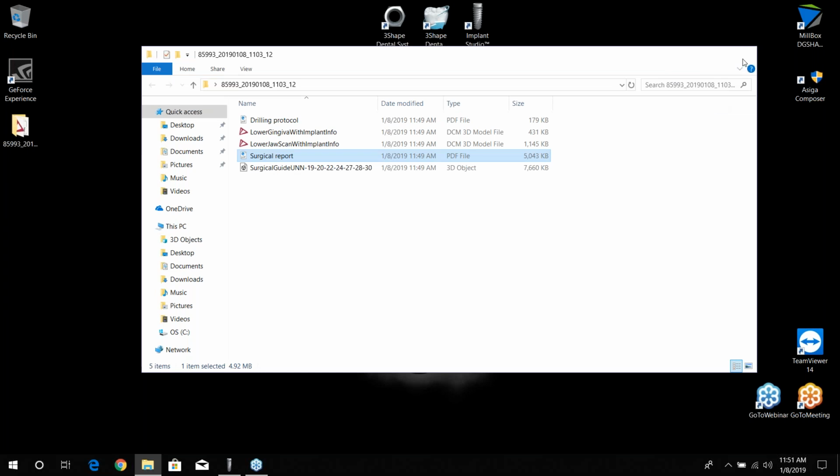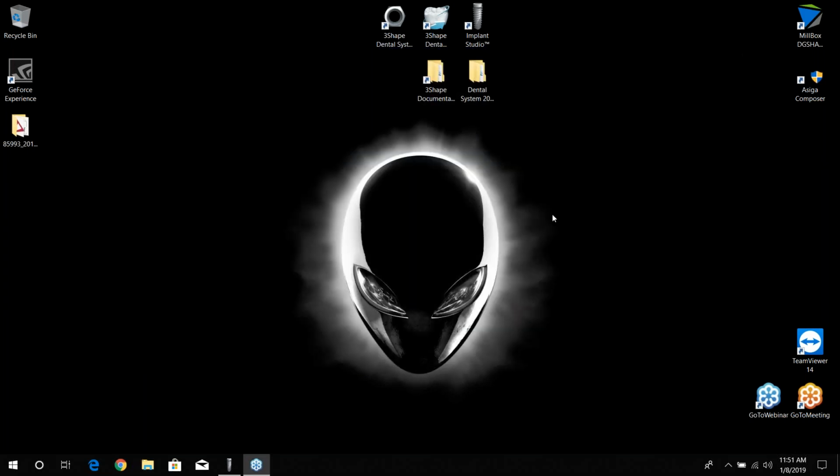All right, Evan, we have actually only one question, at least at the moment, and that is, do the sleeves have to be added into the guide manually after the guide is printed? Yes, there is no current manufacturing technology that allows you to have the sleeves inserted during the actual printing or milling. So you print it out or mill it. Most people are printing it because it's just faster and more cost effective. And then you would buy your sleeves or have them on hand, and after it's printed and post-processed, you would insert and glue the sleeves.